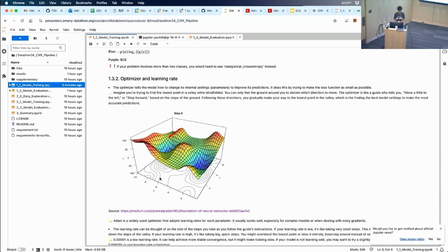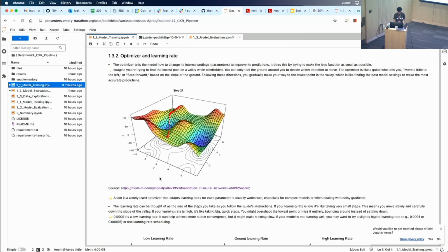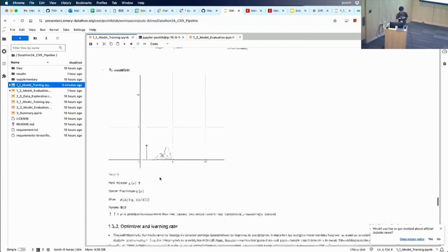But you need to know, is the model learning the right thing? Is your student learning the right thing? If you say, guess the number, and they make a wrong guess, you penalize them. So you see that high bar jumping off the loss function. When they're very close to the truth, that's what you want. The function tracking this visualization is the BCE, okay? Maybe at least a nod if someone is following. Okay, good.